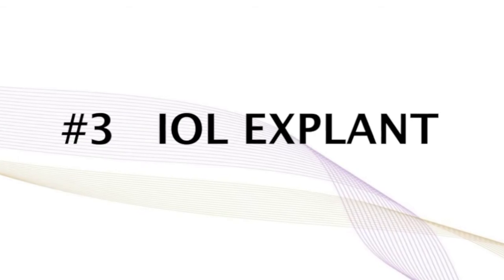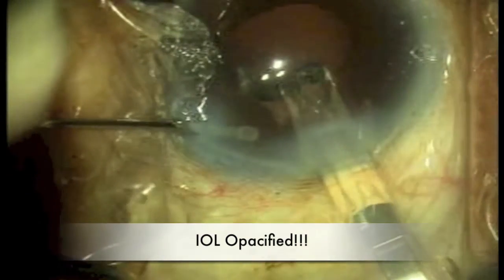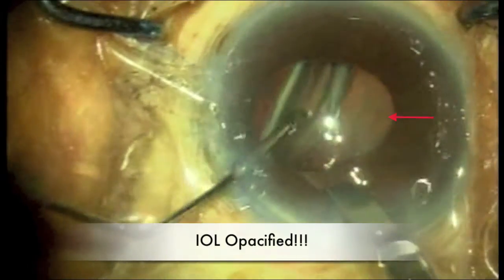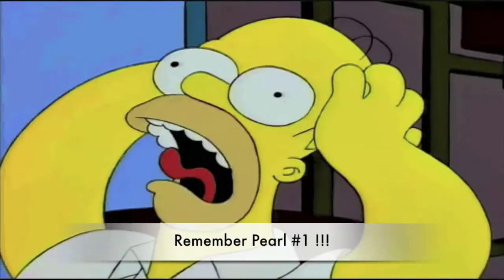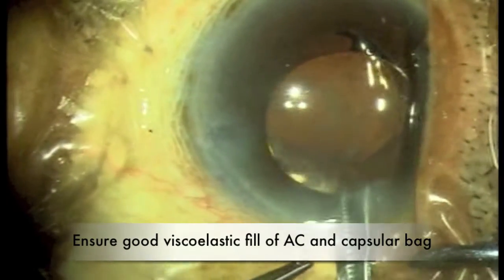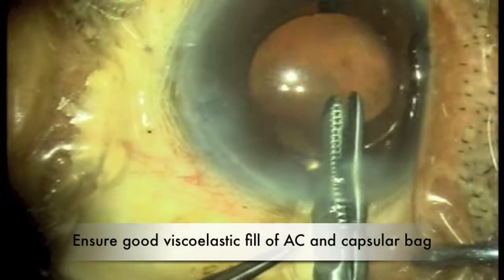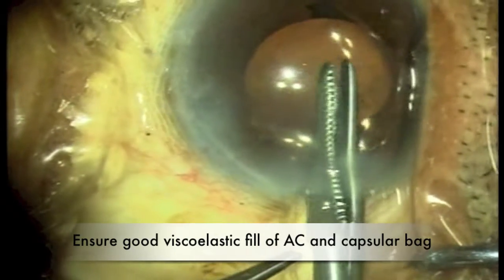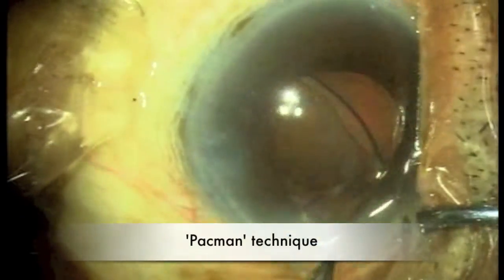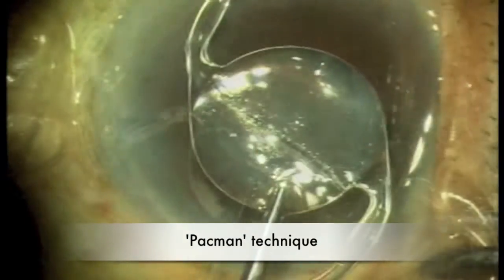Pearl number 3 focuses on intraocular lens explantation. In this example, the intraocular lens was noted to be opacified after it had already been injected into the capsular bag. Always ensure there is good viscoelastic fill of the anterior chamber and the capsular bag before exteriorizing the IOL and cutting it for removal. A Pac-Man technique is used in this case where there is no need to transect the intraocular lens completely.